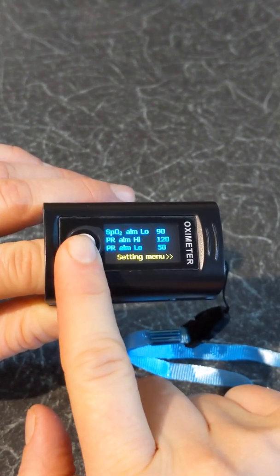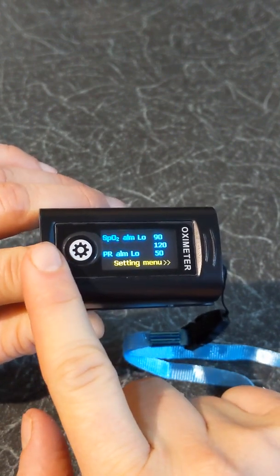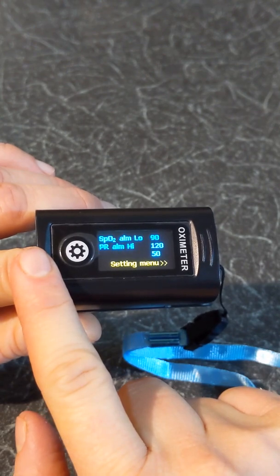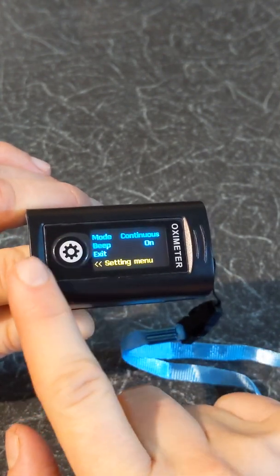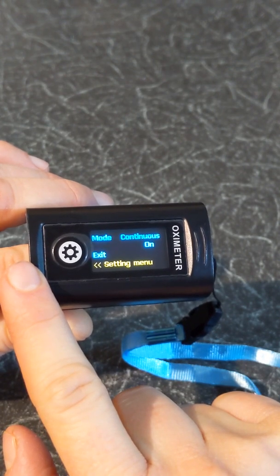In the settings menu, you can switch between having the oxygen level alarm low, the pulse rate alarm high, the pulse rate alarm low, you can change the mode, and you can adjust the beep. Always consult your doctor before changing any of these settings.